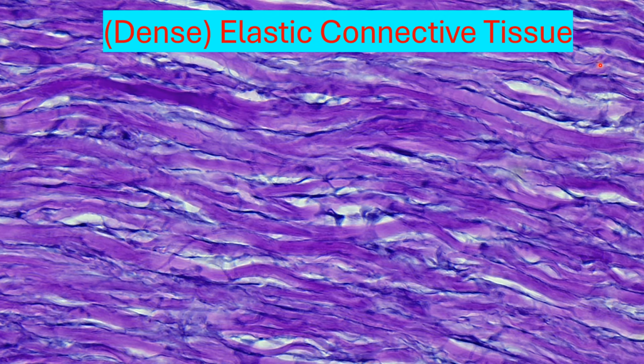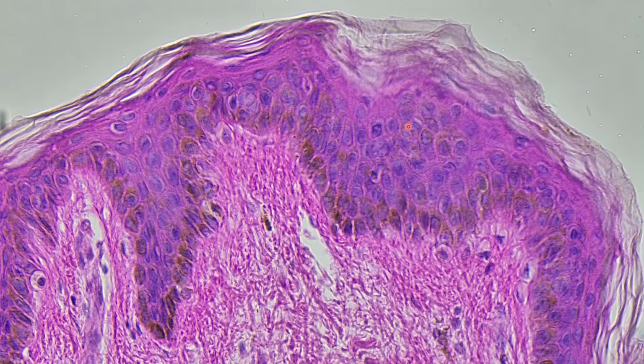It's very similar to dense regular connective tissue, but because it has that elasticity to it, it has that added benefit in addition to the tensile benefits of the collagen bundles. Identify this tissue here.